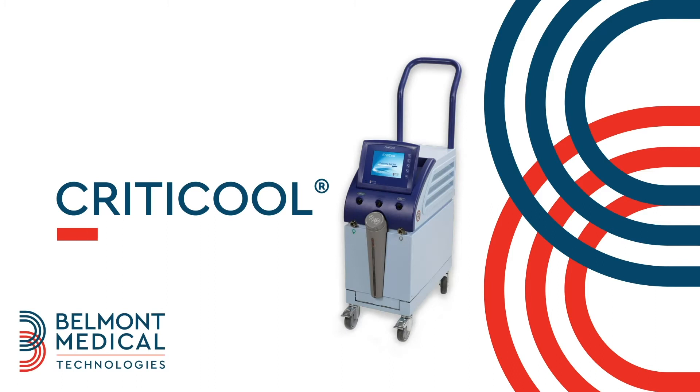Hello, this video will walk you through the basic operation of the CRITICOOL system. For further details, please refer to the CRITICOOL user manual.